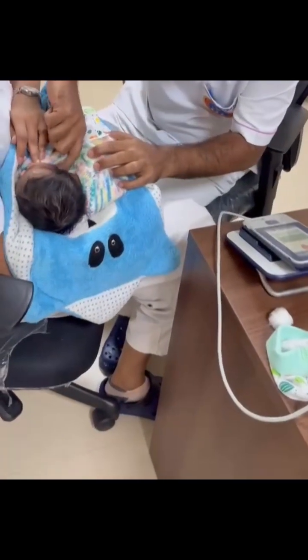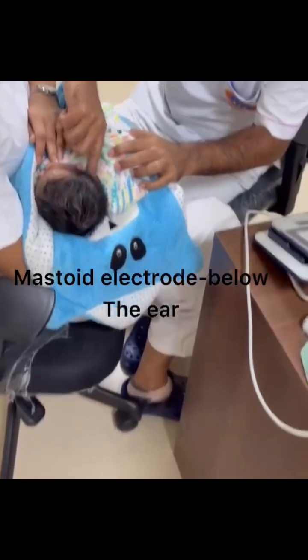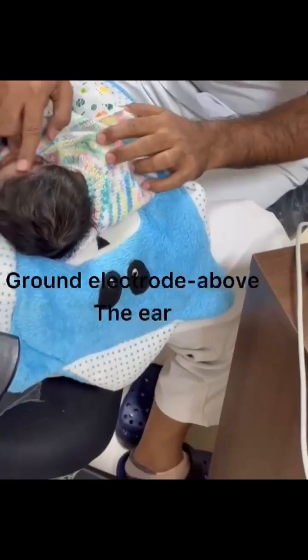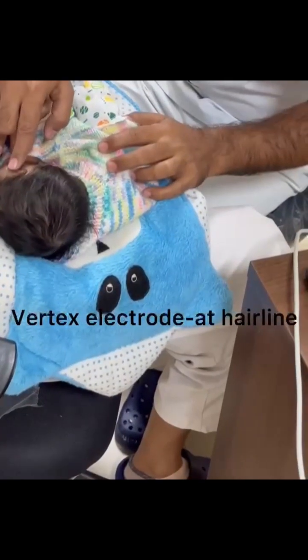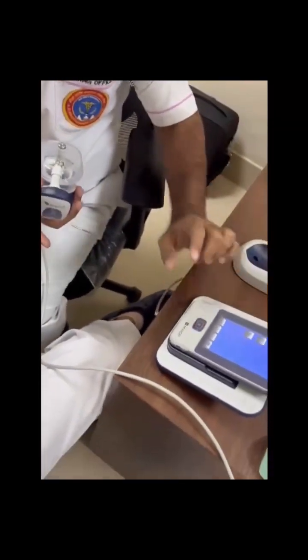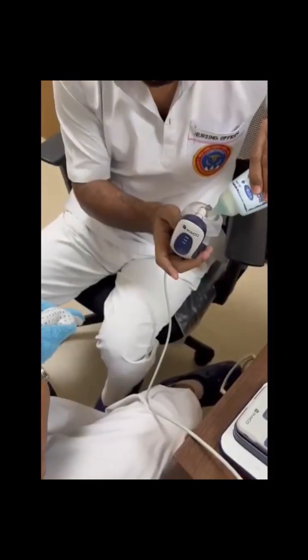At each of the three electrode sites: the mastoid electrode is placed below the ear, the ground electrode above the ear, and the vertex electrode on the forehead at the hairline. Place a small drop of electrode gel on the top of each of the BARA phone electrodes, and make sure to achieve good contact with the prepared skin sites.